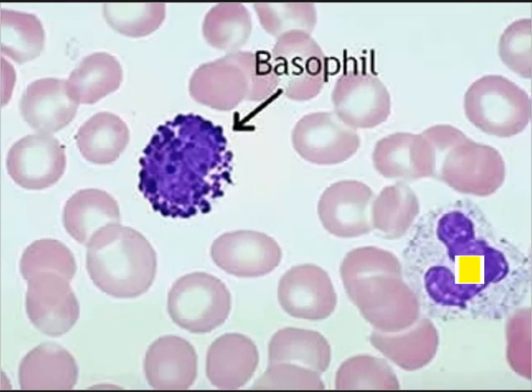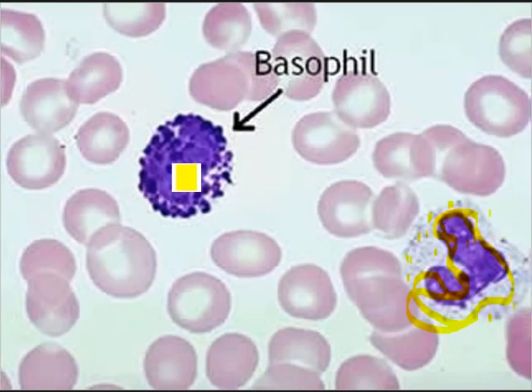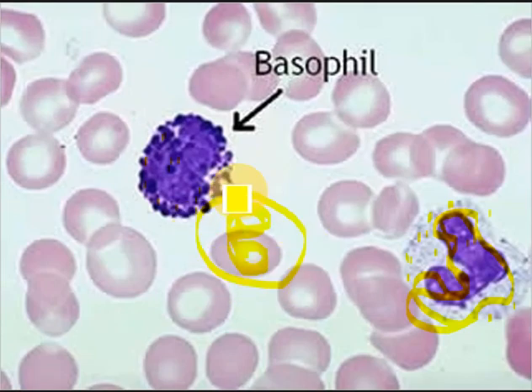Now, so you can see, this is your neutrophil, this is your RBC, this is your segmented neutrophil. It has granules, but they're not really dominant compared to your basophil. Okay, it's really dark blue black granules. It's not the same as your eosinophils, because the eosinophil's color is a little bit orangey compared to your basophil, and its nucleus is like a telephone configuration or headphone configuration.